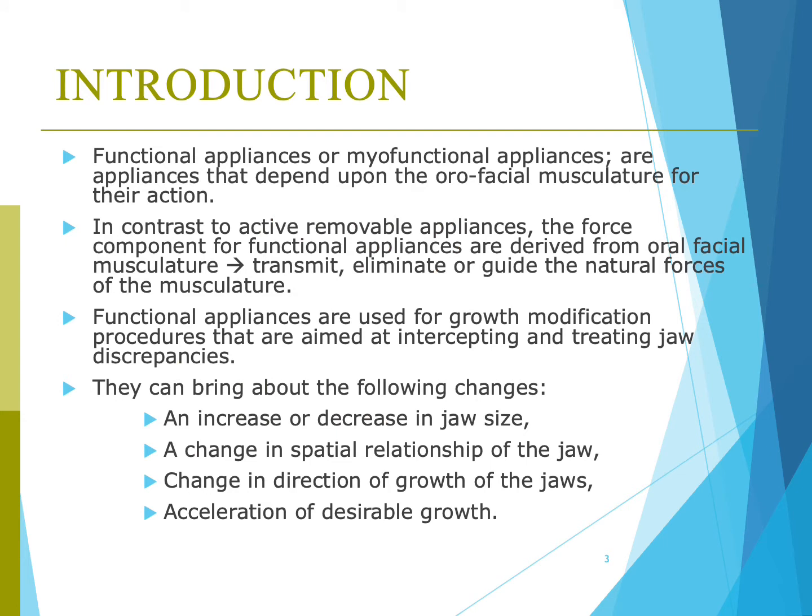As for introduction, the functional appliances, also known as myofunctional appliances, are appliances that depend upon the orofacial musculature for their action. In contrast to active removable appliances, the force component for functional appliances is derived from the orofacial musculature.